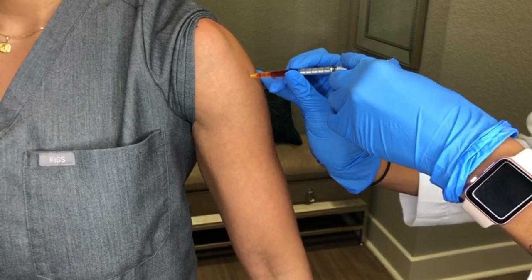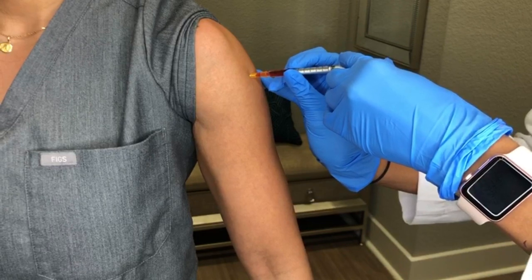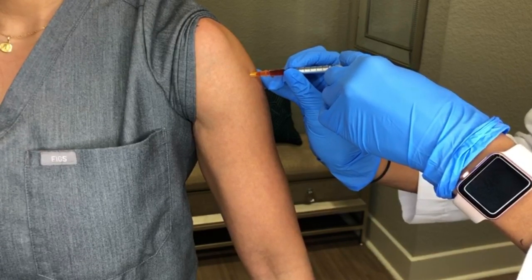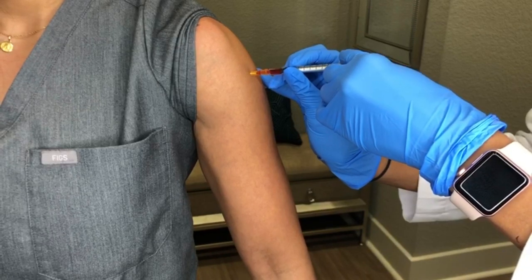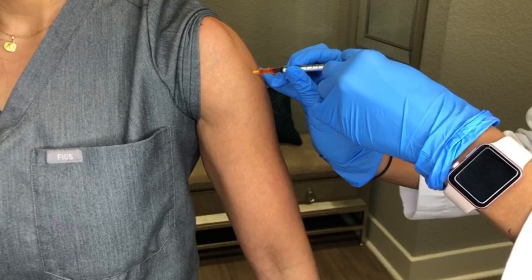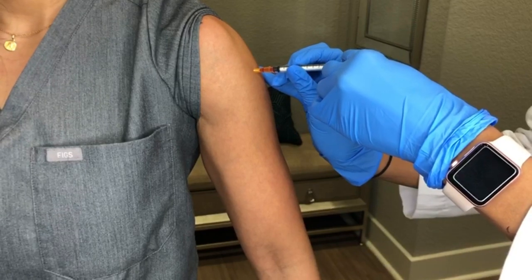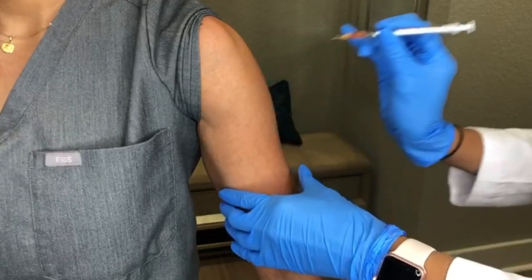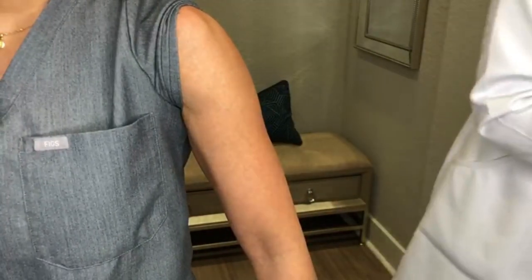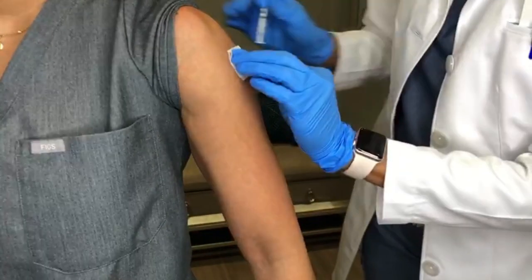You may notice that it takes longer to inject testosterone as it is oil based and thicker. Slowly push down on the plunger to inject the entire dose, then remove the needle swiftly to reduce any discomfort when pulling out. Clean the injection site with an alcohol pad and use the pad to massage the injection site to prevent any knots or bumps from forming.